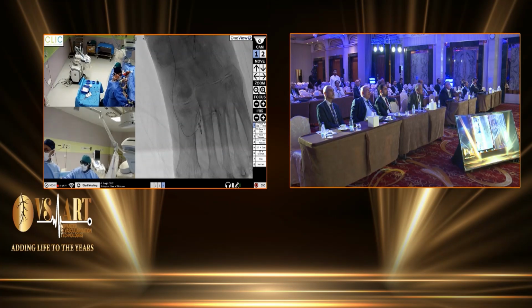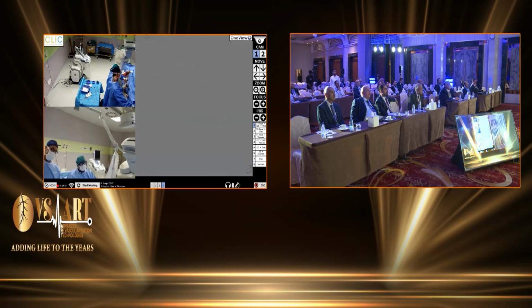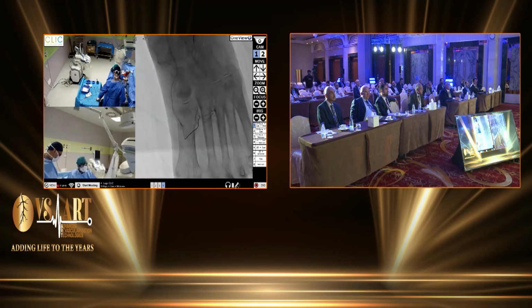Nick, show the... I performed a super selective angiography through a 2 millimeter, 2 centimeter Armada XT balloon. This is the aspect, the initial aspect. I advanced the catheter, and this is in the lateral view. There was a connection. But you can see the aspect that the tissue is not excellent.